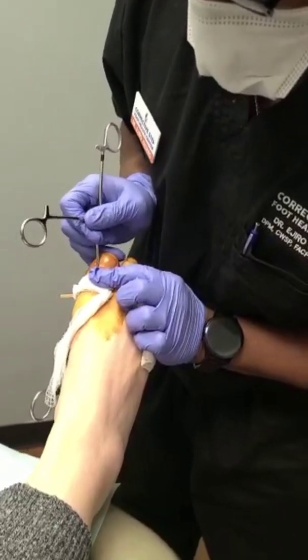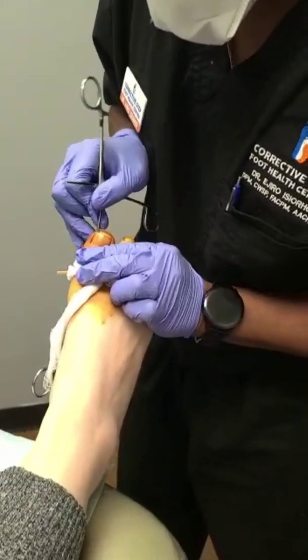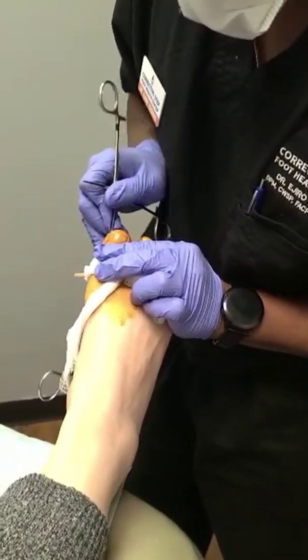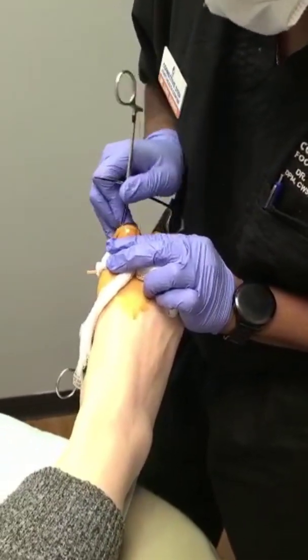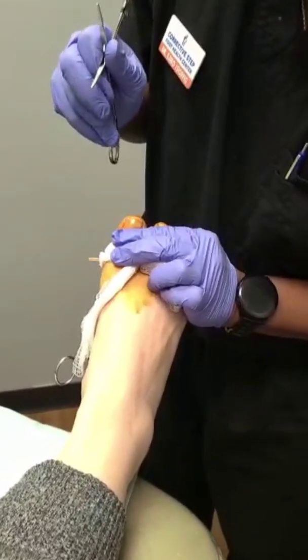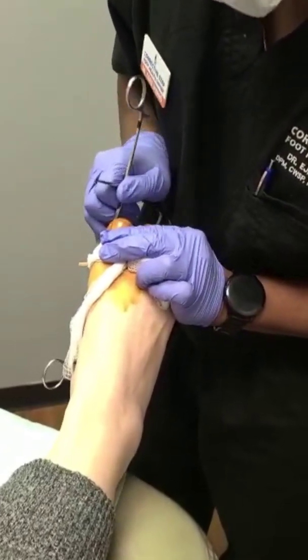So we can just pop that portion out really easily on that nail. This is about as far back as I'm going to go on this corner. Then we get the underneath portion and we just walk it, work it back. You may feel some pressure. The rough side is going towards the nail; the smooth side is going against the nail bed.